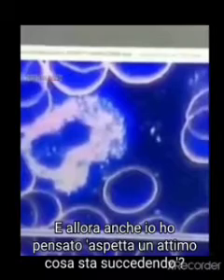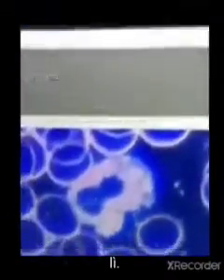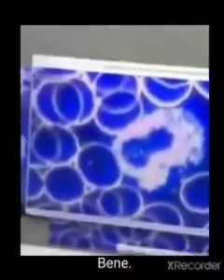I have never seen a white blood cell like this, so it was for me also like, wow, what's this? Why is this so aggressively working? Right. Like you could say if an autoimmune activity or something goes on, the cells attacking something very strong. So it was not a normal white blood cell which we saw here. Okay. All right. So that's the end of the slides.